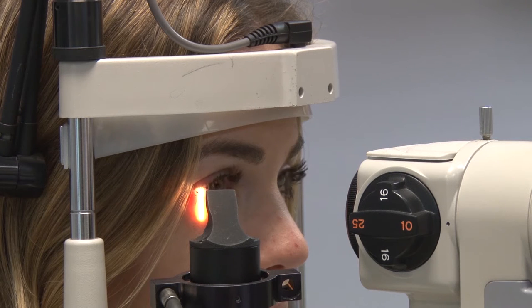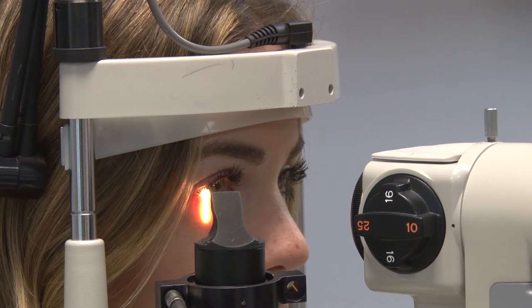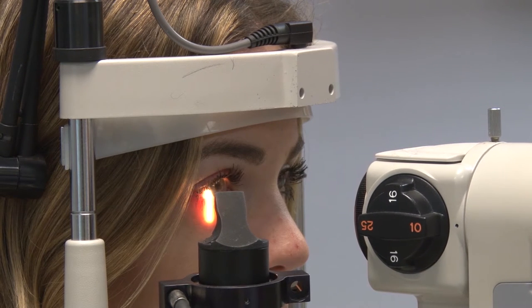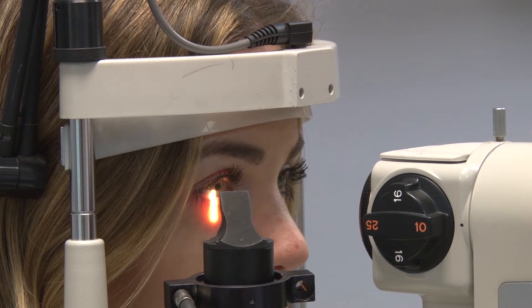You want to be verbalizing what conditions you should be looking for as we look at each of these structures. For example, as I sweep the lower lid margin, my expectation is that you'd be able to tell me you're looking for signs of blepharitis, plugged meibomian glands, entropion, ectropion, hordeolum, and chalazions. As I'm coming across, the lid margin is dipping down a little bit, so I'm slowly lowering the beam with the control stick so that I don't get the light in her pupil.